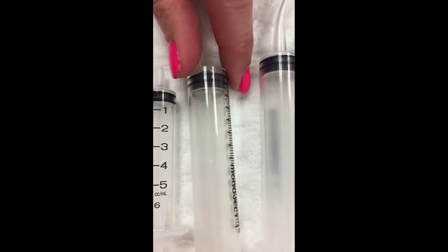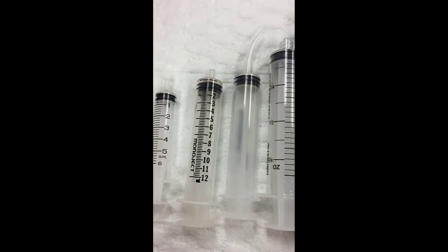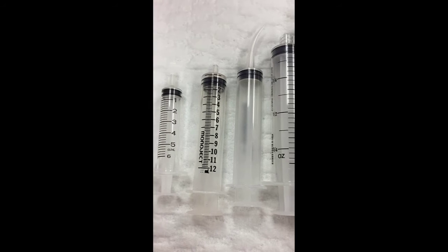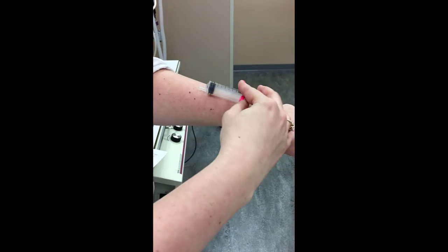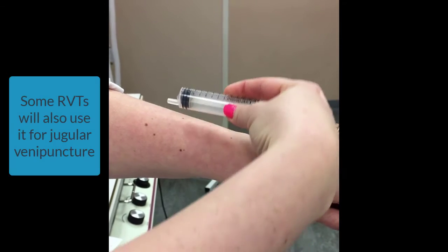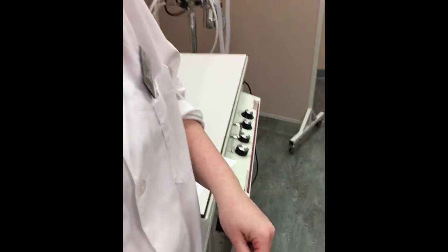Now these ones are not used as commonly, and you can get other 12 mil syringes that have the normal centered one. These ones are typically used for giving medications or fluids to patients through an IV catheter port. So that way it will balance flat on the patient's limb. So if I have an IV catheter here, I have the injection port here, and the syringe will actually lay parallel and go directly into the IV catheter port. It ends up not being on an angle. So it's for easier access and use for the technician.